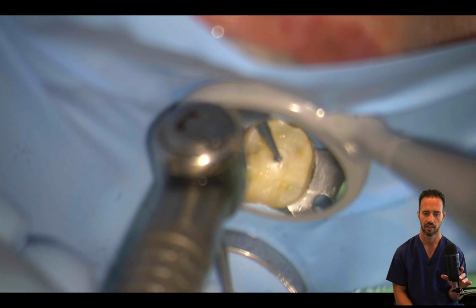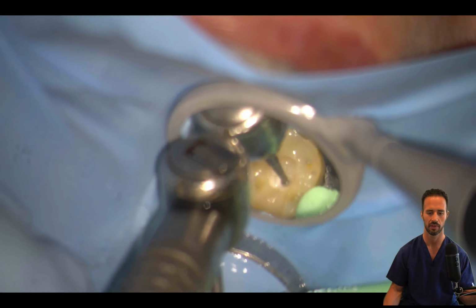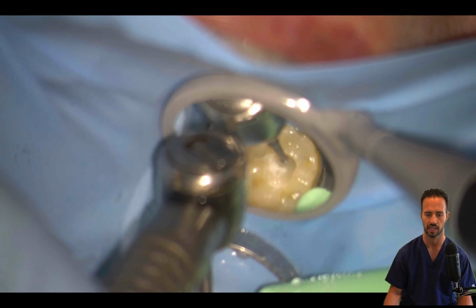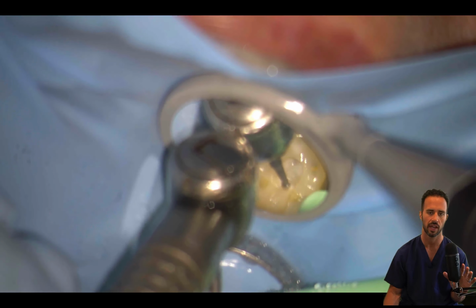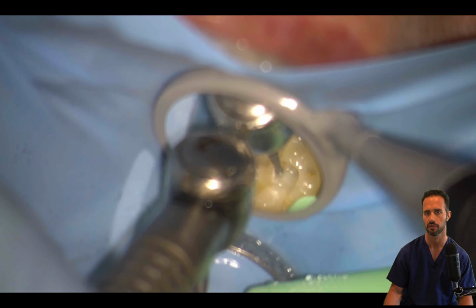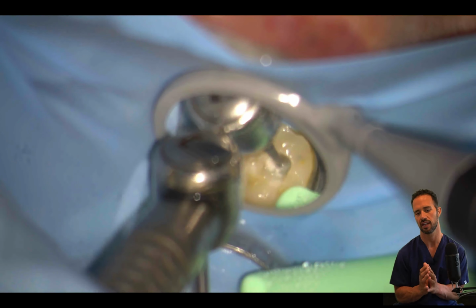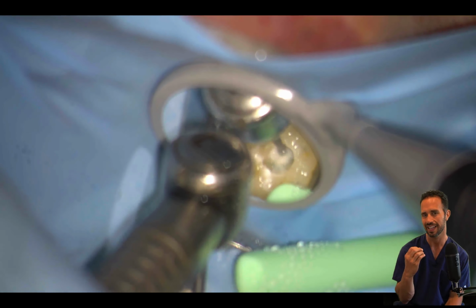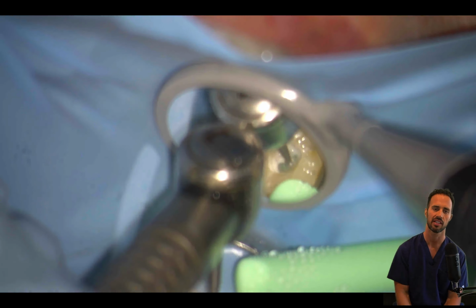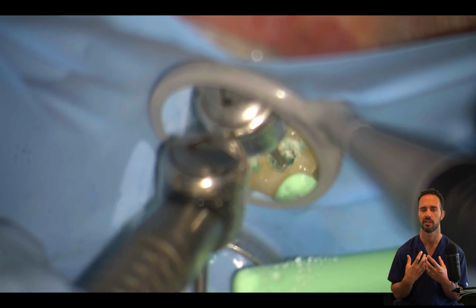And clearly I'm a little slow here because I'm messing around with the microscope and the camera for you, but this should be a pretty quick little step to take out the Fuji 9. And if you had Cavit, it's even easier because it's a soft material, obviously. But I'd recommend using the Fuji 9 most of the time, just so you have a much stronger temporary restoration. They're less likely to dislodge it and thus need appointments to replace the temporary restoration. It's just a much better temporary.